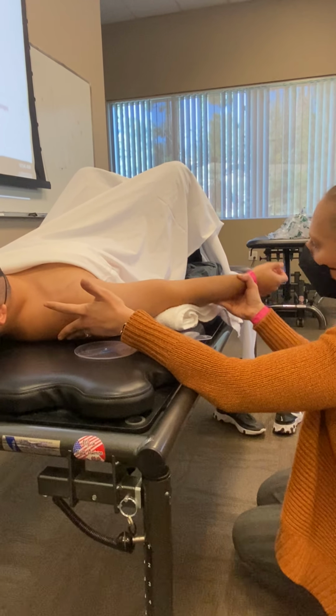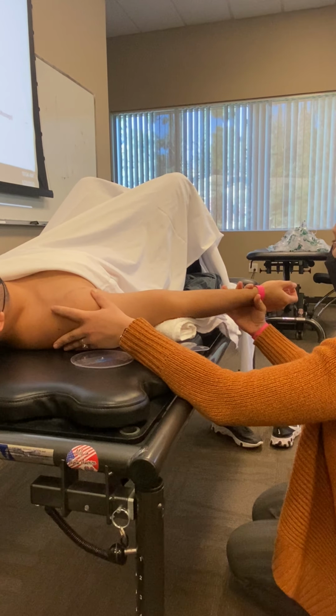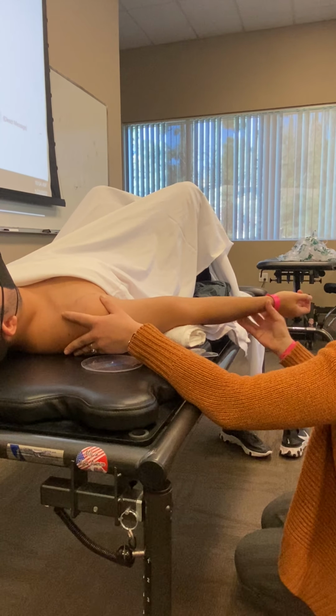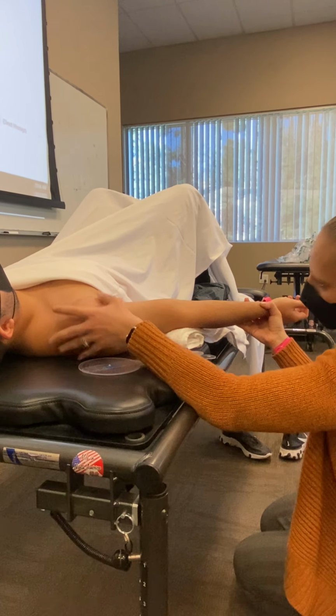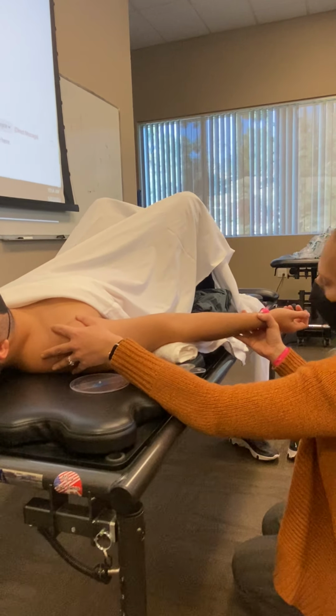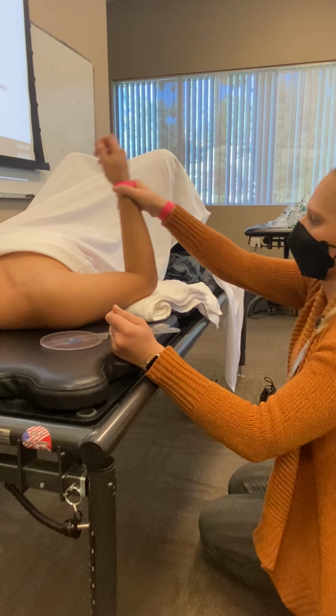Here, if I continue to pull in, then you're starting to get shoulder anterior tilt. You can maybe get some pronation compensation, so just watching for those kinds of things. But I'm stabilizing here at the shoulder. I'm not getting any extra movement. It's that hard end feel. He looks like he's at 0 degrees. Any pain there?